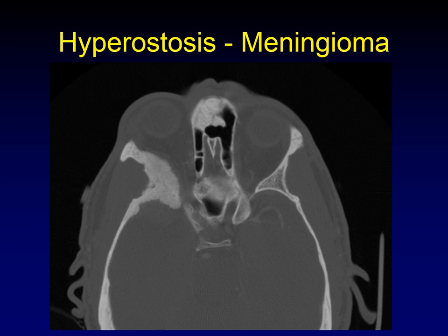Hyperostosis also occurs from many different sources, the most common and familiar one being meningioma. This looks just like ground glass from fibrous dysplasia and it maintains the underlying configuration of the bone. However, this is occurring in a classic location for meningioma in the sphenoid buttress, and you can see a hair-on-end look of the hyperostosis — not characteristic of fibrous dysplasia. There's also a soft tissue component of the meningioma spreading into all three surrounding compartments.